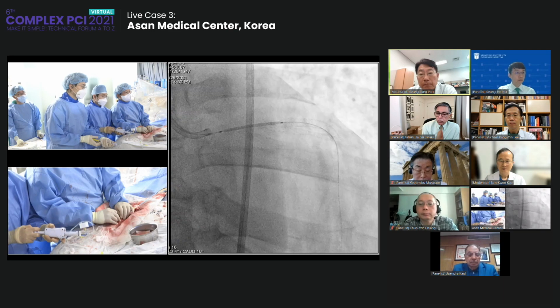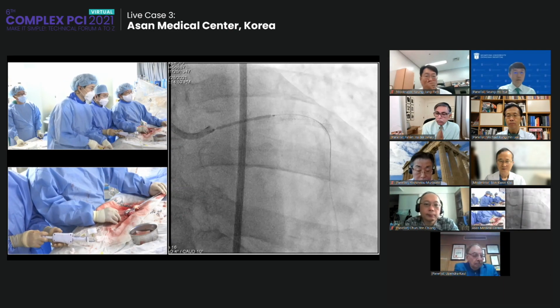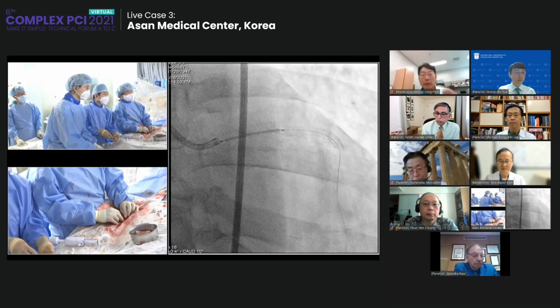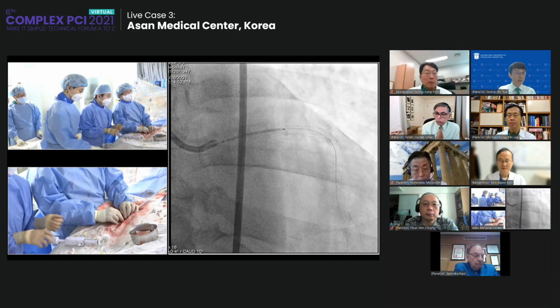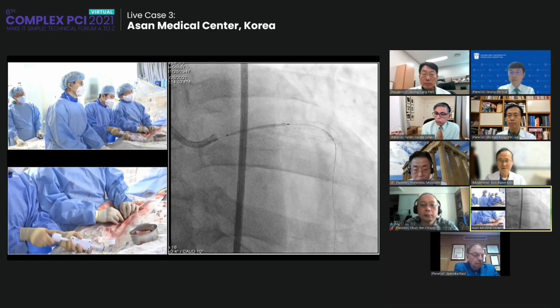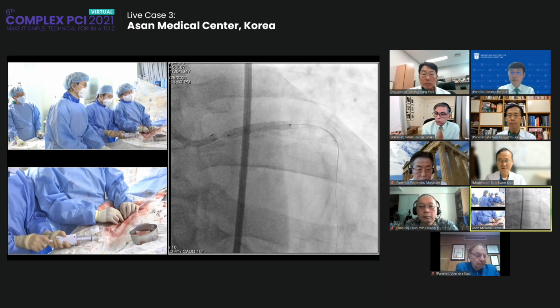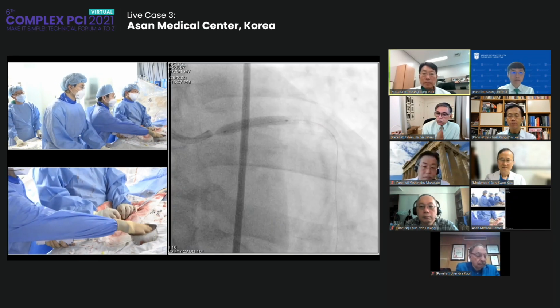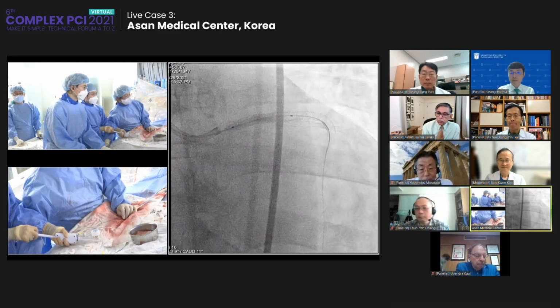Rest. Okay. Test. Inflation, 12. Great. Deployment. Stent is fully expanded.